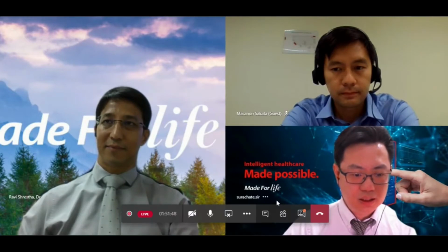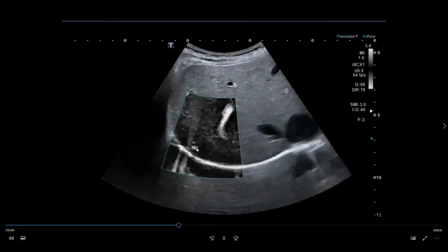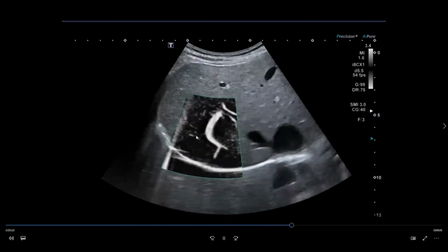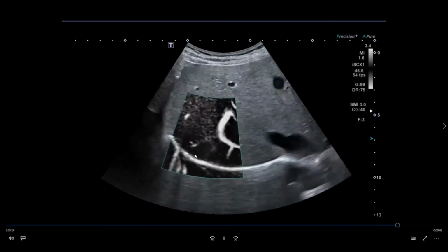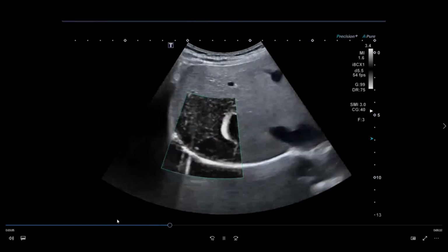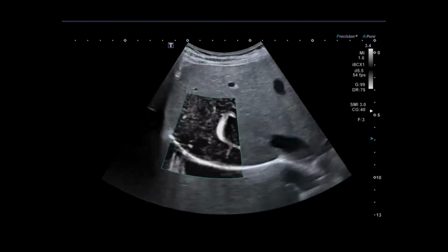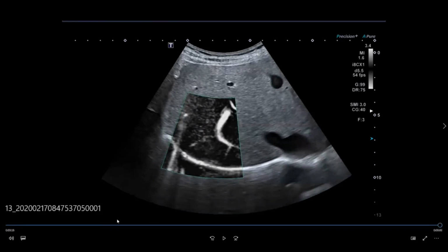The second one, for lesion characterization: from the publications, it's quite typical for hemangiomas that we have a ring with dot flow like this. I'll show you my case here. Okay, this is a case of hemangioma. We see the rim vascularity with the dot like here, representing the slow flow, peripheral slow flow. This is quite typical for hemangioma. We do not observe it in other nodules. So again, we maybe need solid documentation about this, confirmed in many further studies, but in our experience and preliminary data, it's quite useful and specific for hemangioma.